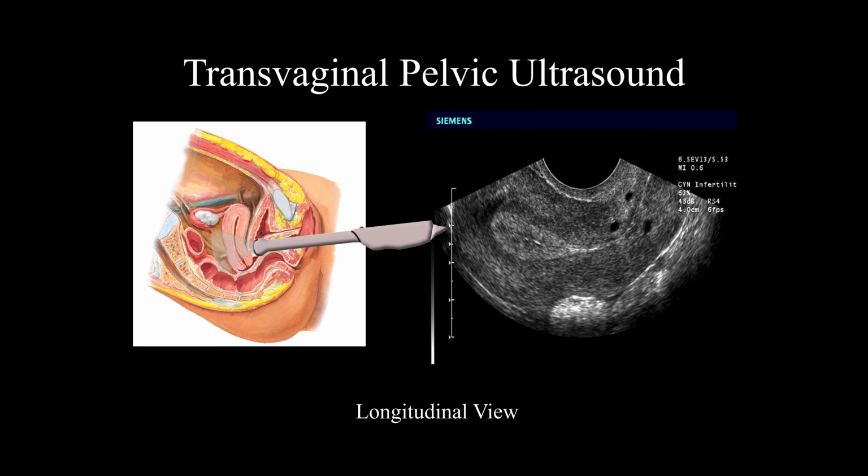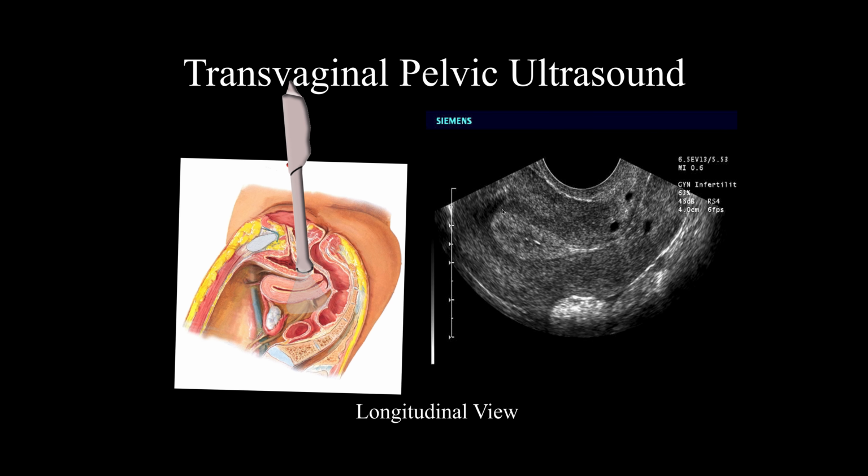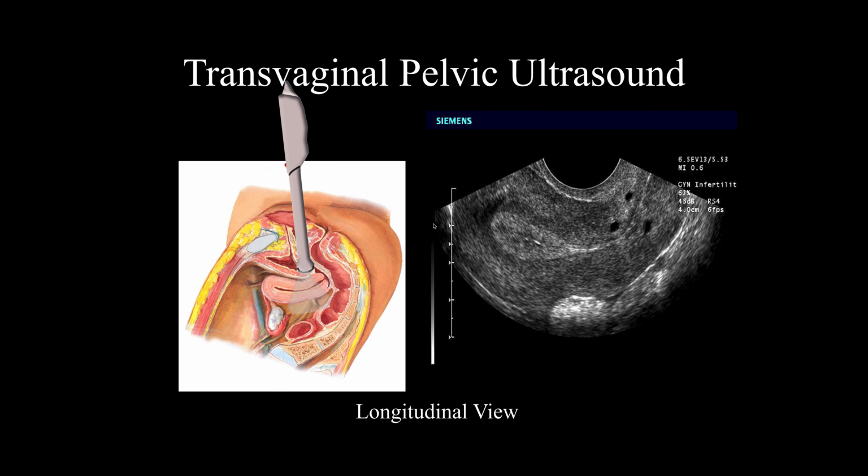So you'll be doing an ultrasound through here, and it's kind of tricky because the image is probably more like this, where the probe is here touching the uterus like this. This way, when you take your hand and pull down towards the floor, the probe head goes up towards the ceiling, and you'll see more of the fundus. If you were to take the probe handle and push up to the ceiling, the probe head would go down, and you'll see more of the cervix.